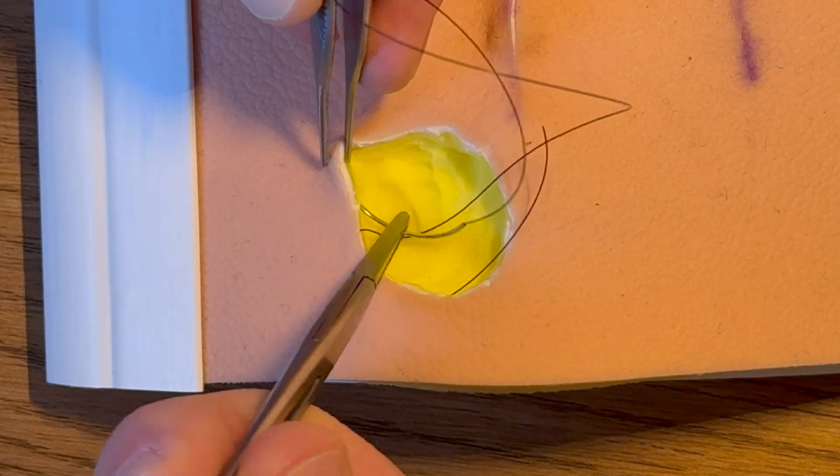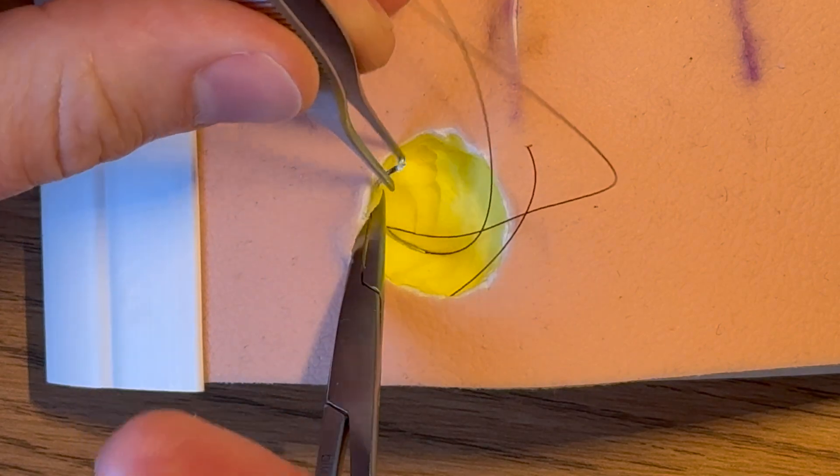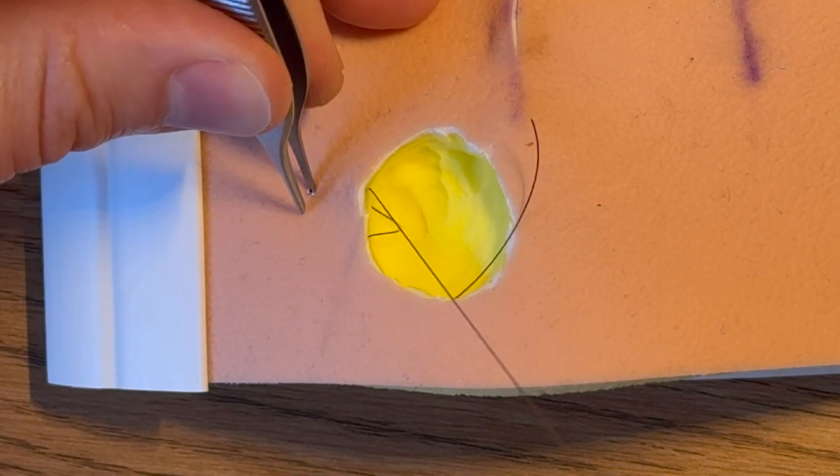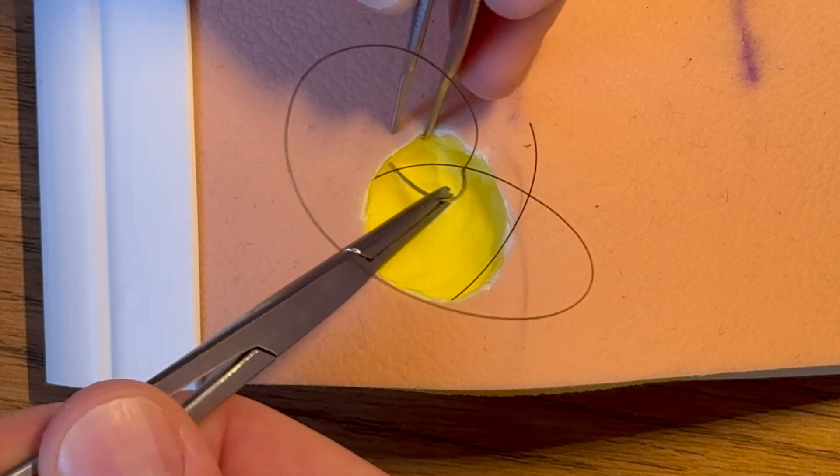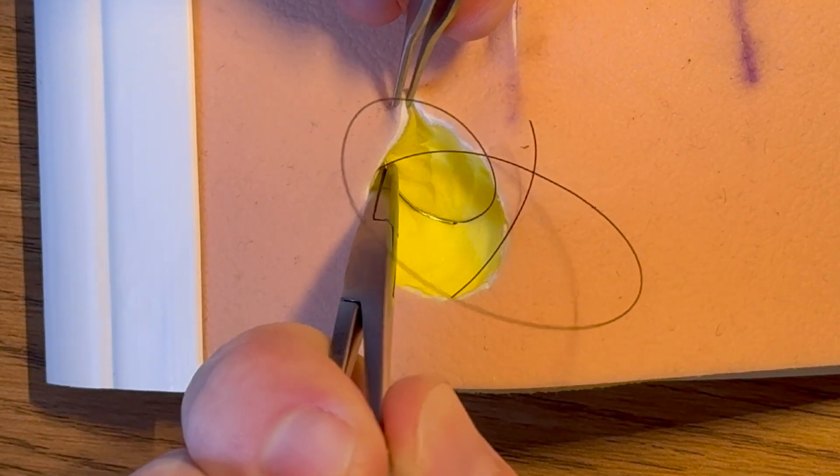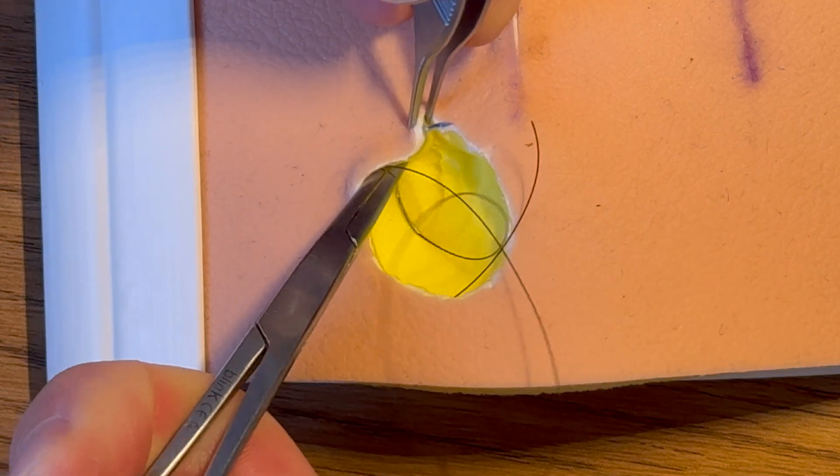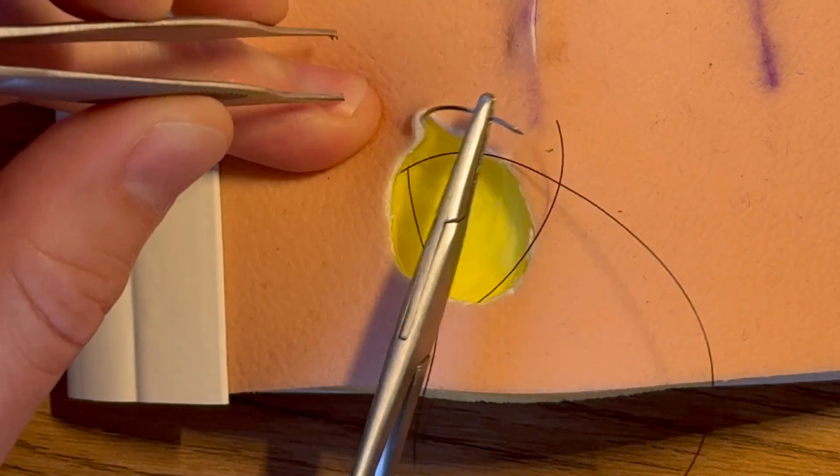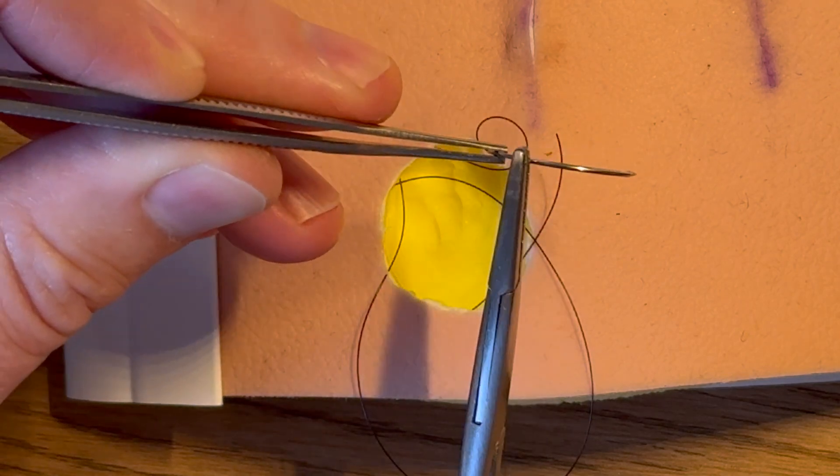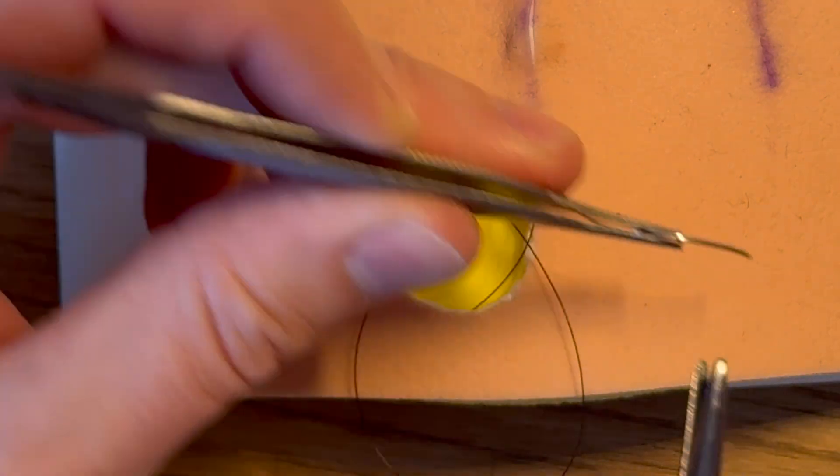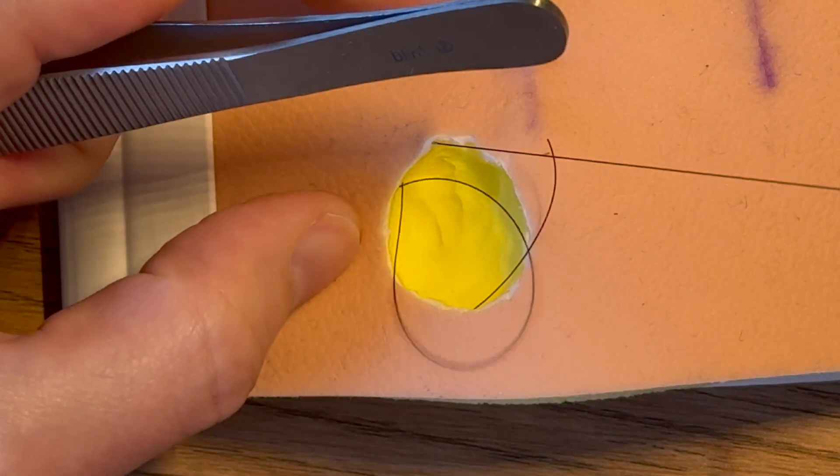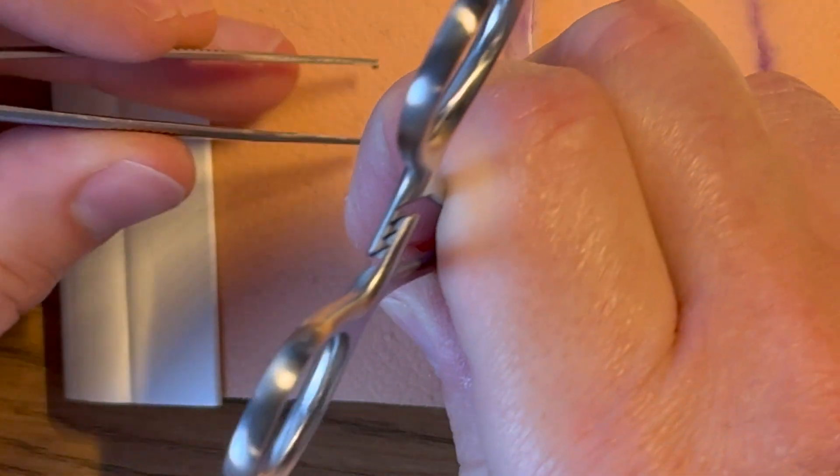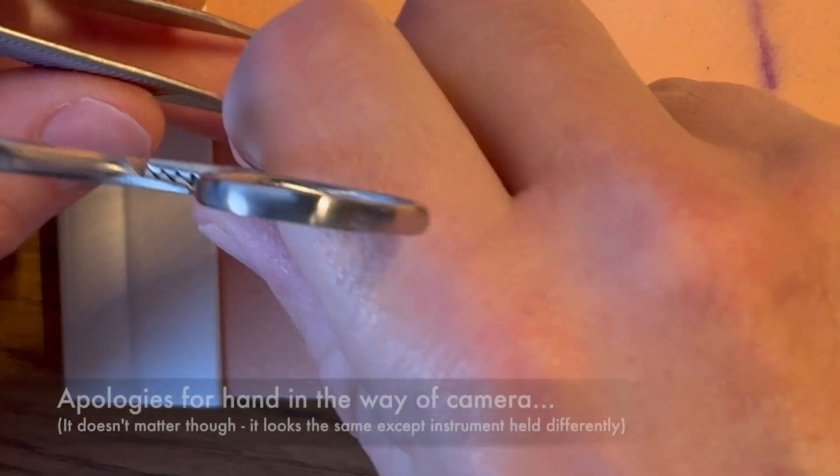I'm going to resist the temptation to turn the fake skin around because you usually can't do that with a human, and we just go around and around repeating that same sort of movement. Or you can take a pencil grip like this and then you can sort of twizzle it in and out.